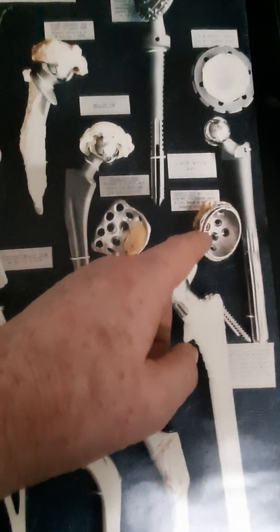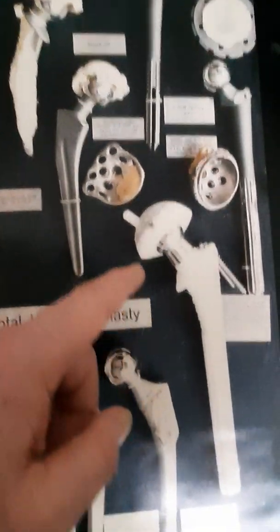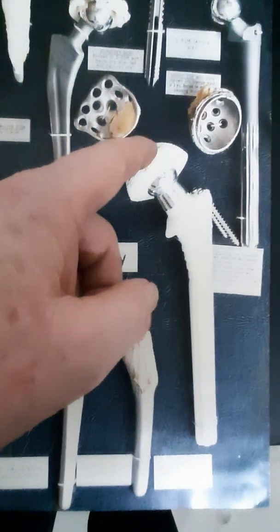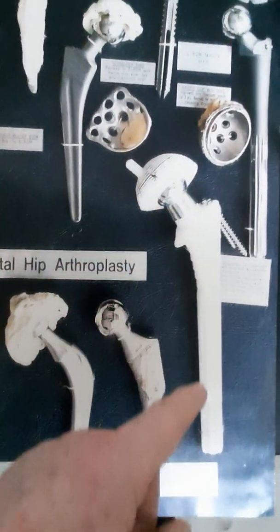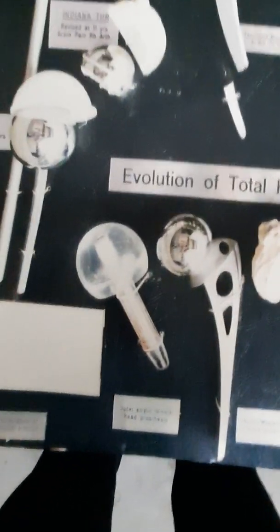Here's an American Harris cup, put screws in it, multiple positions. Here's an Italian one, isoelastic Bombelli, plastic, you see. Had ceramic coating here on the acetabular component, did well there, but not so good down here on the femoral component, loosened up readily. So let's put it all together.